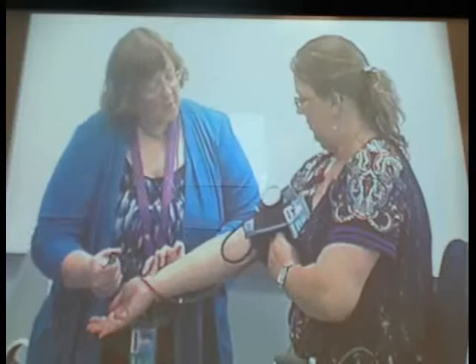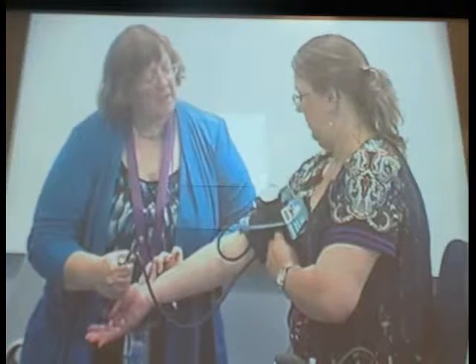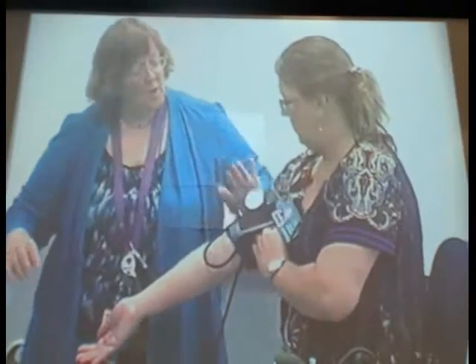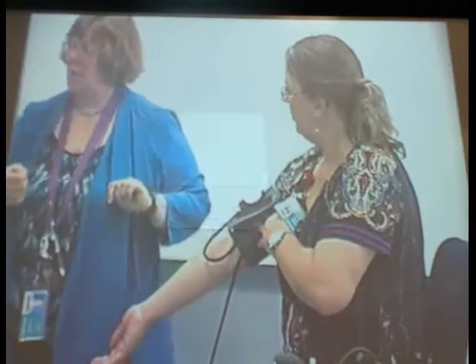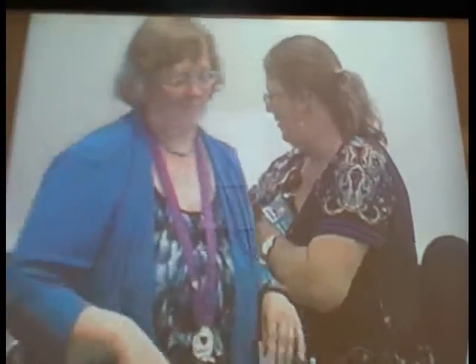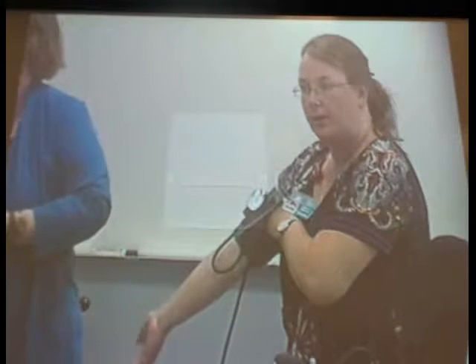I'm going to pump up while feeling her pulse. I'll pump until I no longer feel the pulse, then go 30 mmHg more — that's my baseline estimated systolic. The pulse went away at 90, so I pumped up to 130. This first step is the estimated systolic, so that you don't arbitrarily pump too high and hurt your patient by causing blood pressure to go higher.